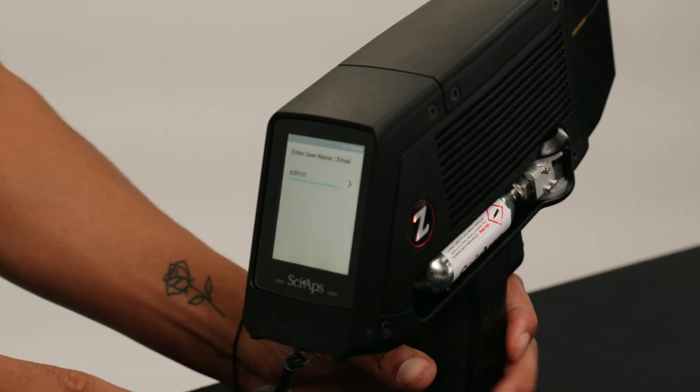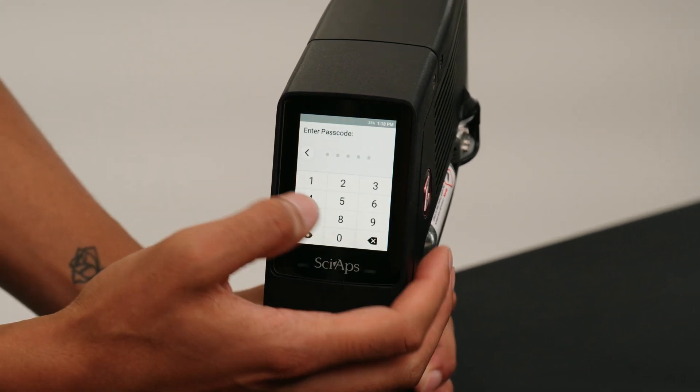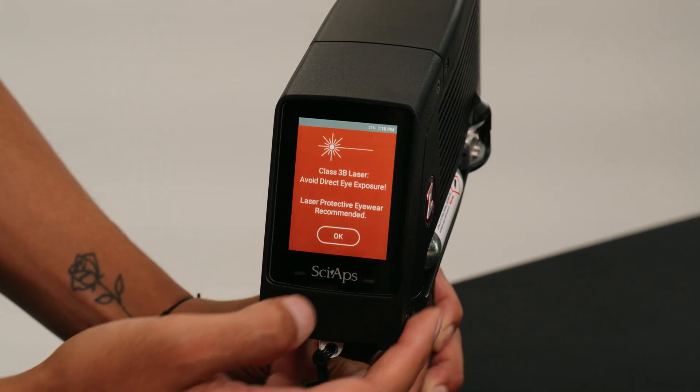First, you would start off by turning the unit on. You'll get to your username screen — admin. Once you get to the password screen, you'll type in your password: 1, 2, 3, 4, 5 — our generic password.